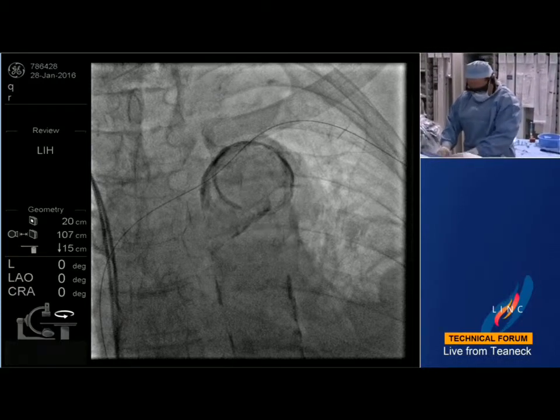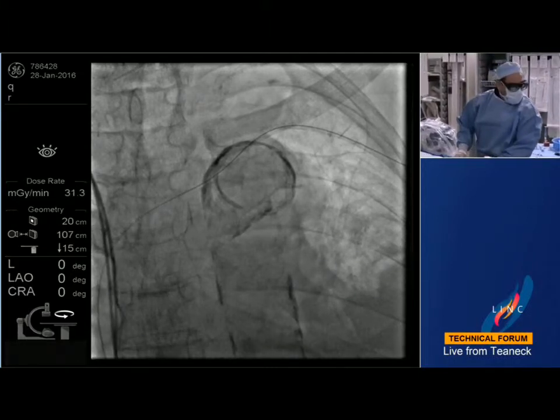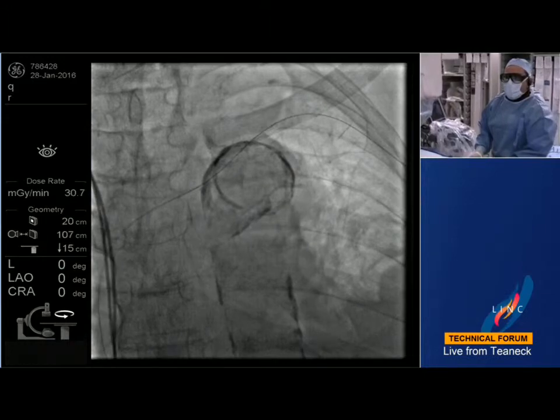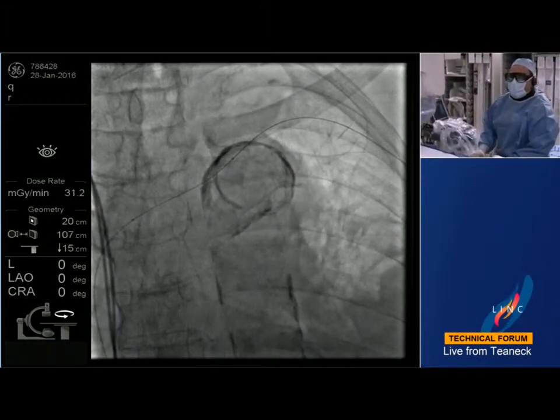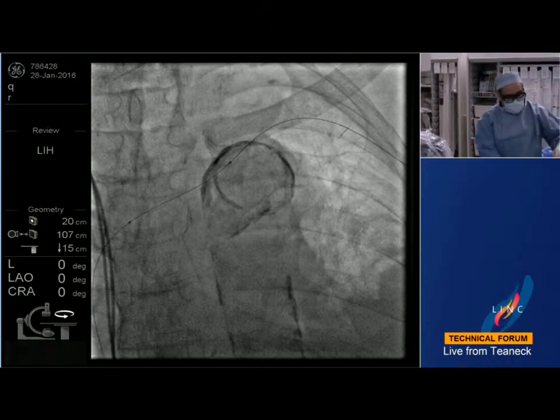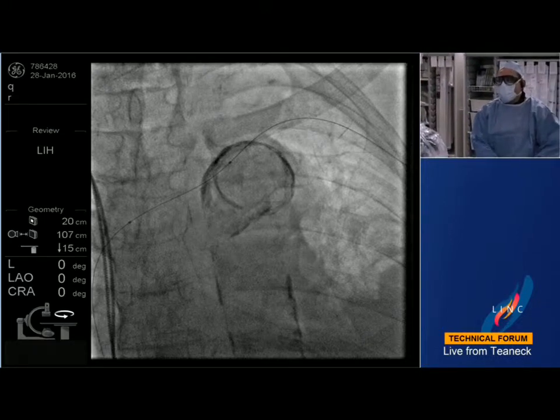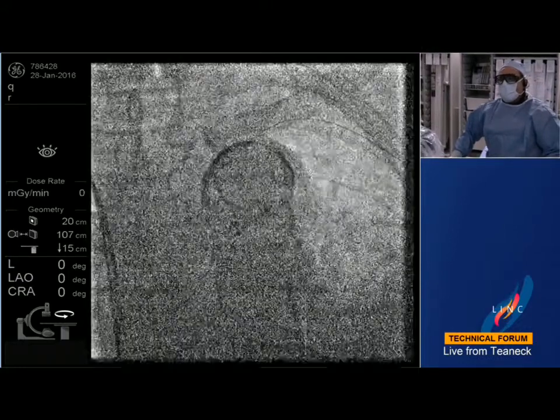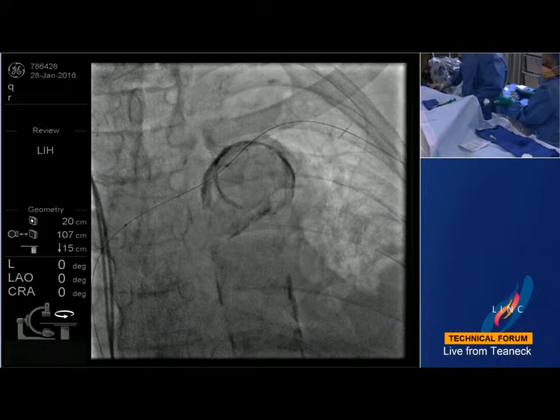Okay. And what type of balloon are you going to use here? So we're using here a Boston Scientific Sterling. It's an 018 balloon, goes through a 6 French sheath. And you could also see the pacer wires on the other side. We've had many patients that had pacer leads and end up with big central occlusions that became very difficult to recanalize on both sides.